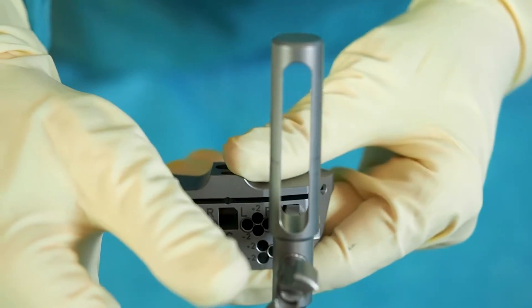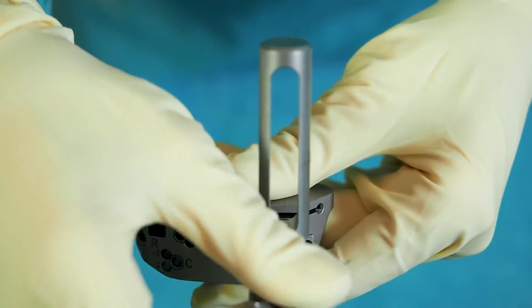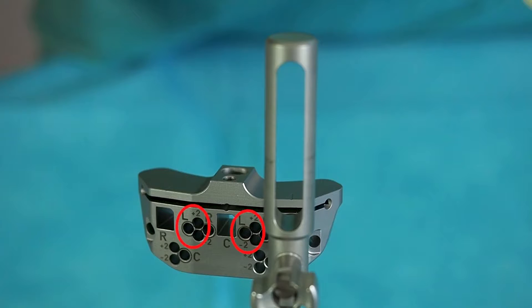In case of a less invasive approach for the left knee, engage the holding rod in the hole marked with L.